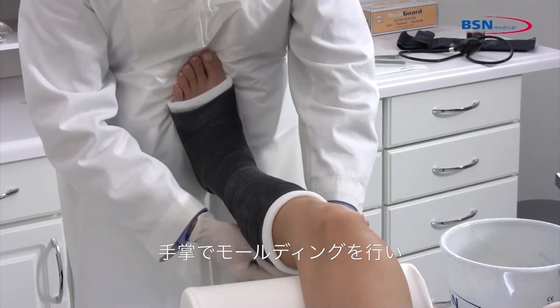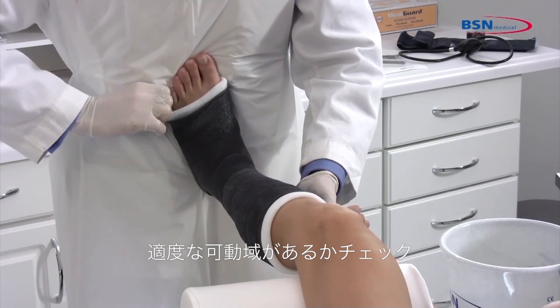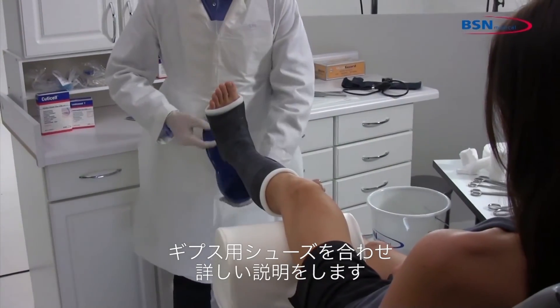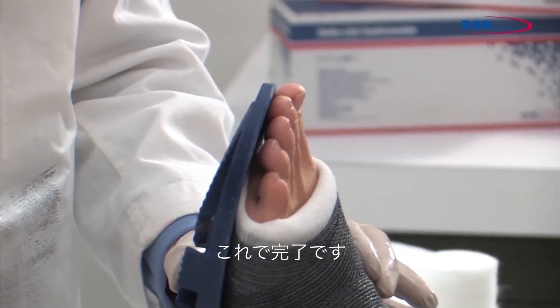Mold the cast with the palms of your hands. Check for any limitations in range of motion. Check for any pressure points that may cause irritation. Fit a cast shoe and give full instructions to the patient. And you are finished!